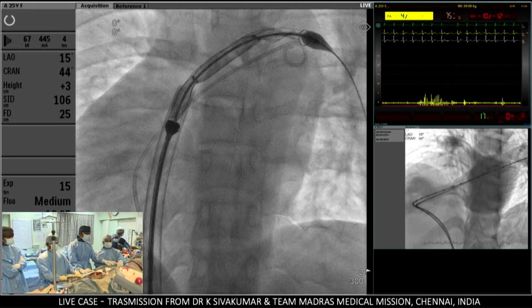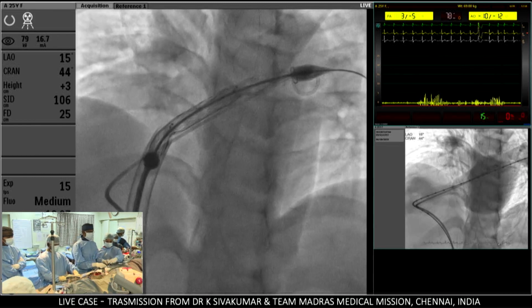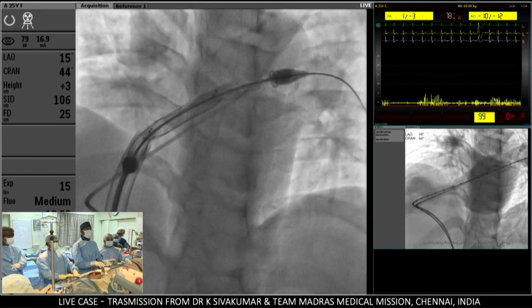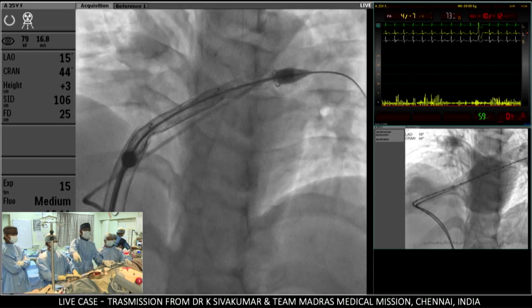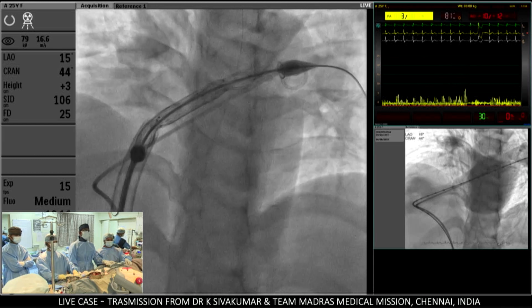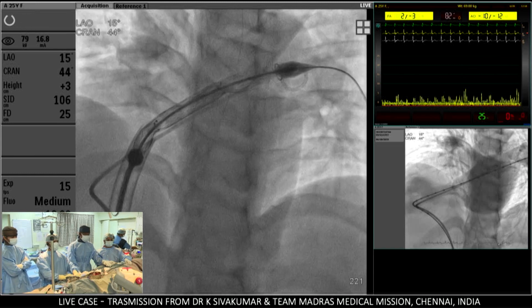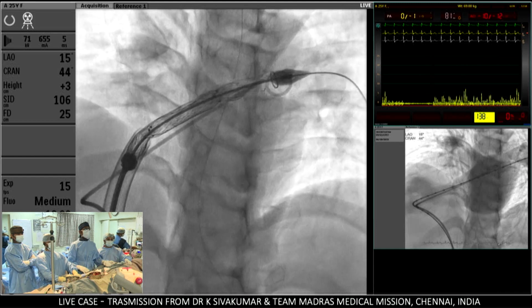Siva, yes? Hi. Just a quick question, how often do you see such idiopathic dilatation of the pulmonary artery needing valve intervention? This is the first one, Eric, that we are doing, because the patient has a regurgitant fraction of about 66. No, I understand, but it really seems unusual. Yeah, I've got Varakan and CC here who've probably put in a lot of P valves. Let's get some comments from them.